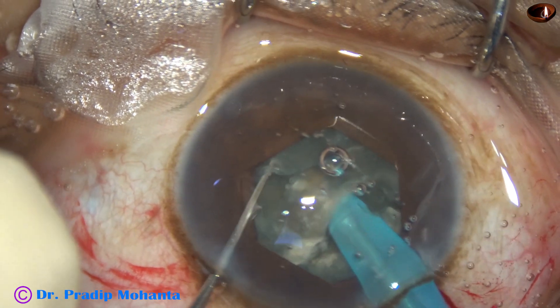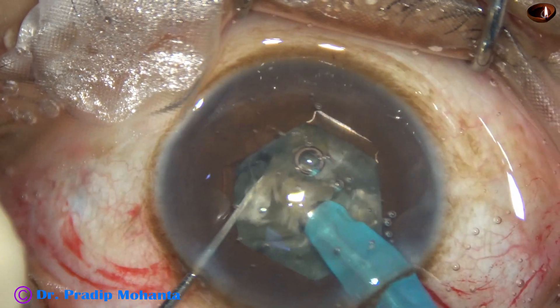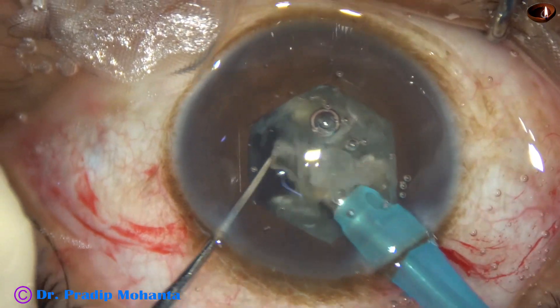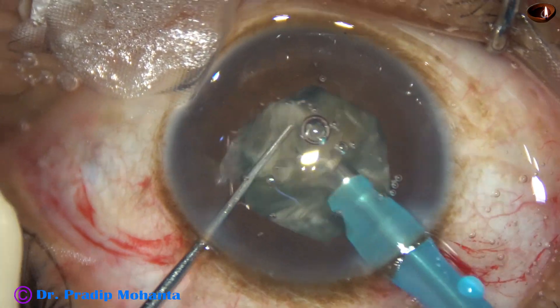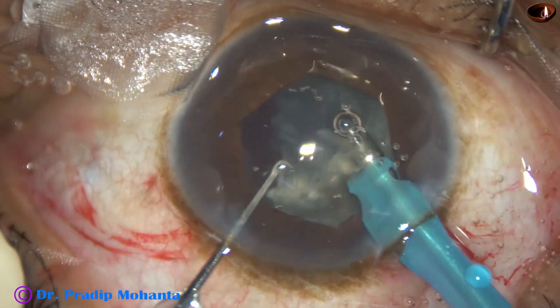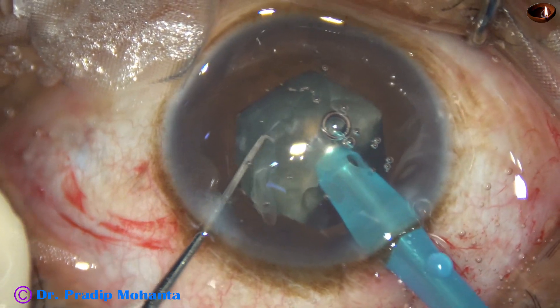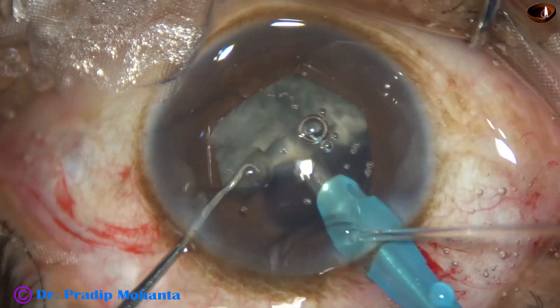I come to one hemi-nucleus and chop it into two pieces. One piece is tilted and emulsified. The ultrasonic energy used in this case is 80%, flow rate is 40, and vacuum is 400 mmHg. The other piece is also tilted and emulsified. The ultrasonic energy is in continuous mode. The other hemi-nucleus is then chopped into two pieces and the pieces are also emulsified.